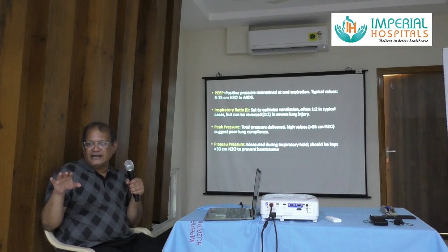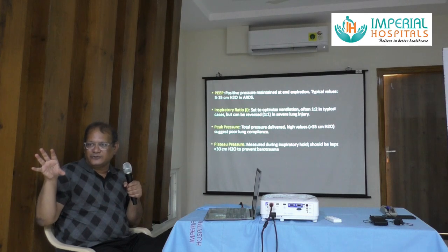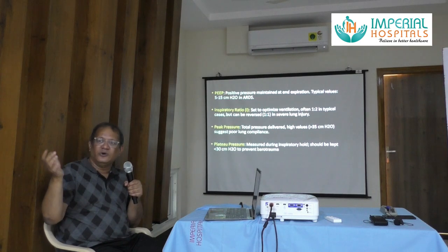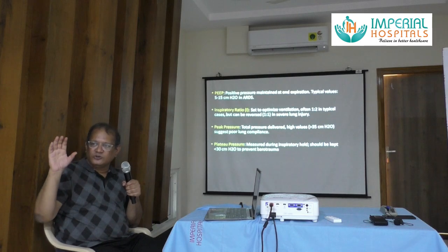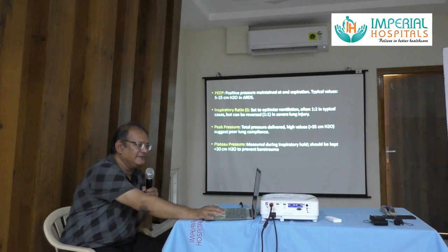Also, recruited alveoli can collapse. What is recruitment of alveoli? Alveoli that have been collapsed, you're giving some positive pressure and you're trying to recruit them. You're opening them up, right? Again, if the pressure goes back to zero, they may collapse again. So to re-recruit them, you'll have to put in more effort. But if you keep a positive PEEP, those will not completely collapse, and so you'll maintain recruitment there.